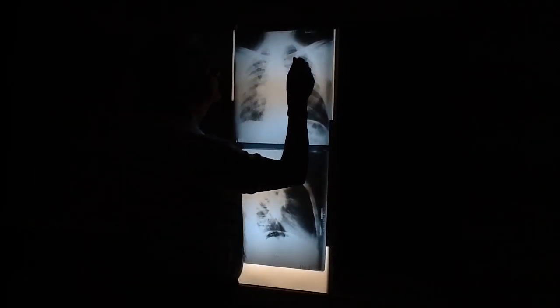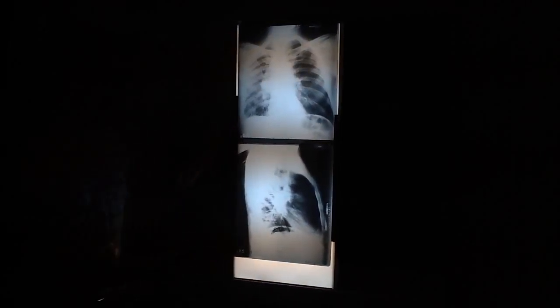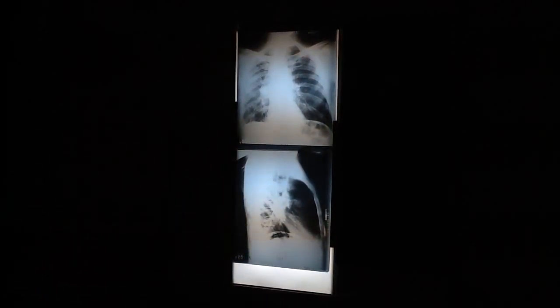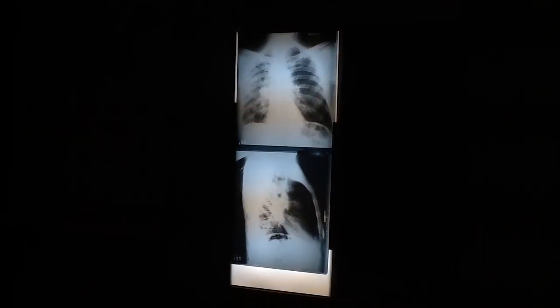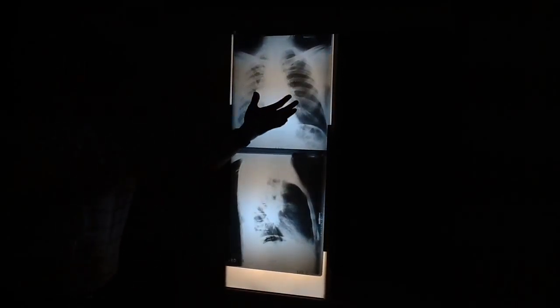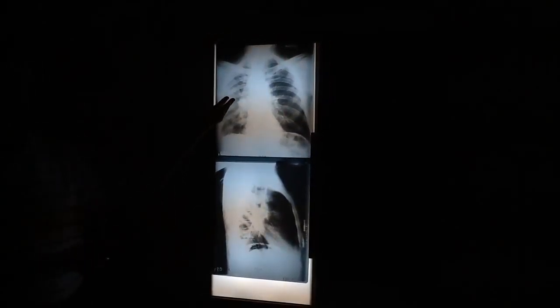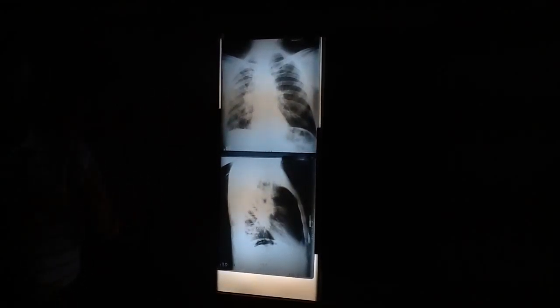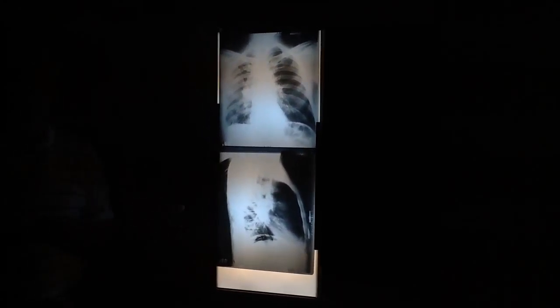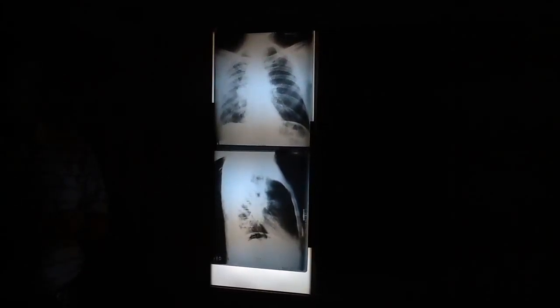And then we've got this. We may even have some destruction in this one right here. So what is this patient's staging going to be? 4. Yeah. This, even though it's thoracic, it's still Mets to the skeleton. That's distant Mets. That's bone Mets. This is an M1. It doesn't matter what the T and the N is. This is an automatic M1. All M1s are stage 4. Stage 4s have less than 10% 5-year survival. This is probably at best 7-8% 5-year survival rate.